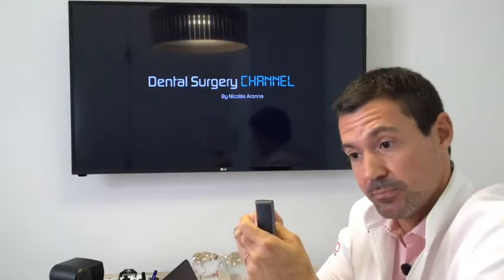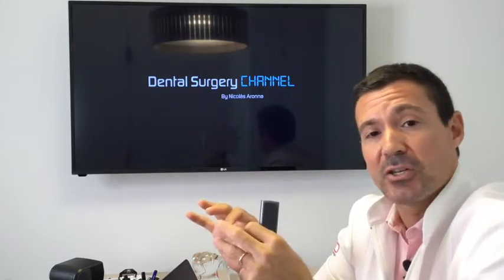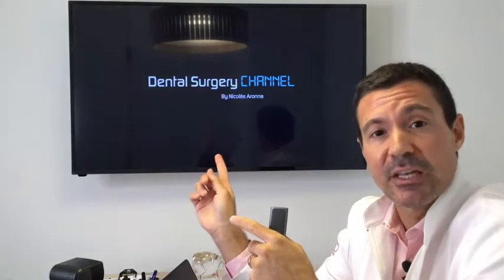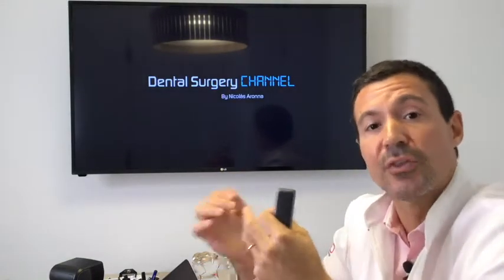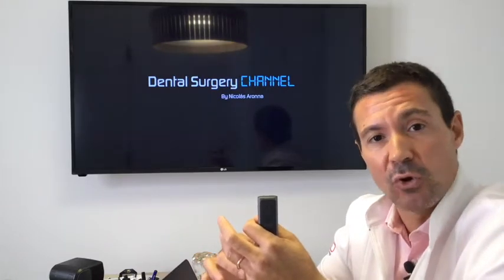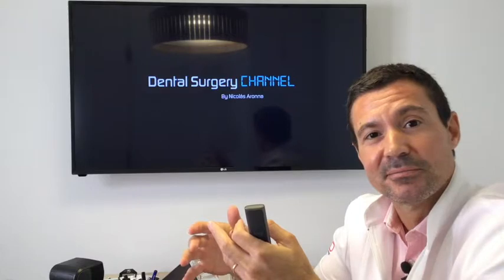When I saw the block of the screw, I stopped, and I told the patient, if I'm not having a passive fit here, I cannot apply 20 newtons, 25 newtons, or 30 newtons centimeter torque with a ratchet, because I might break everything. It's very important. So be safe, understand the problem from the bottom, and try to apply as much knowledge as you have.